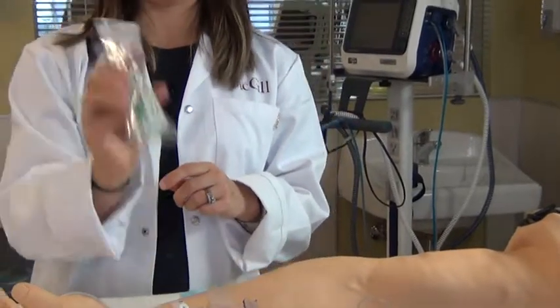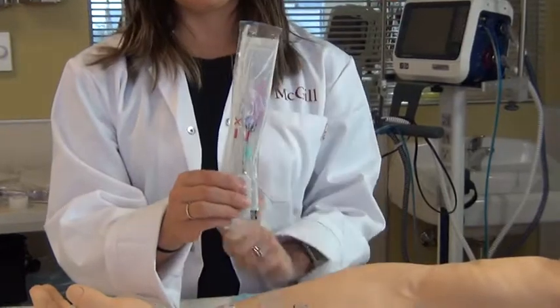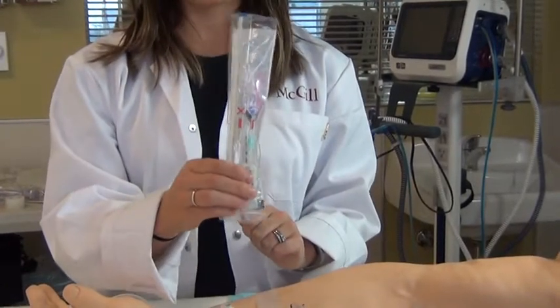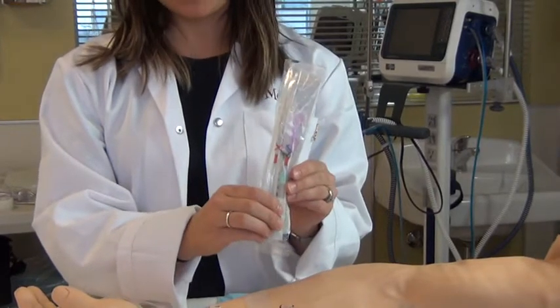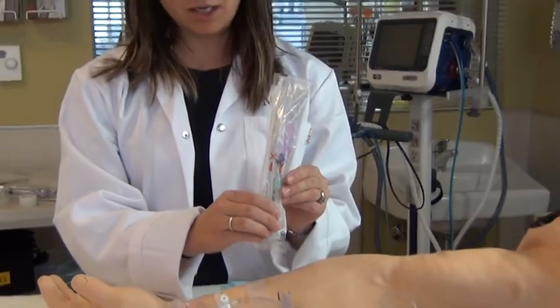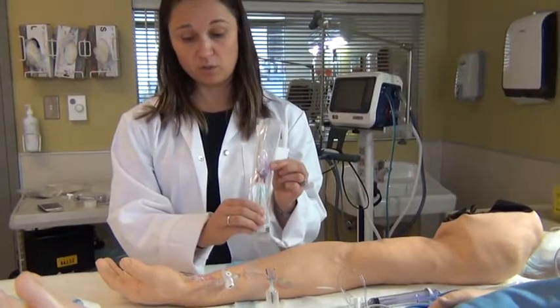Another thing that I want to mention about this syringe is that it actually comes with a needle that can be attached to it for a direct arterial puncture. So if somebody just needed an arterial blood test without an arterial line, a physician or respiratory therapist could go and do an arterial puncture with this syringe.